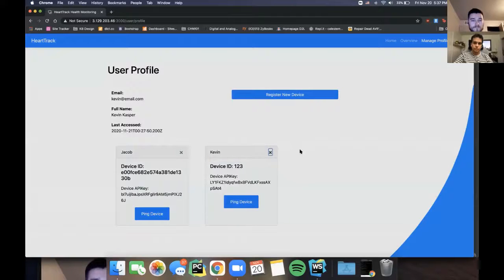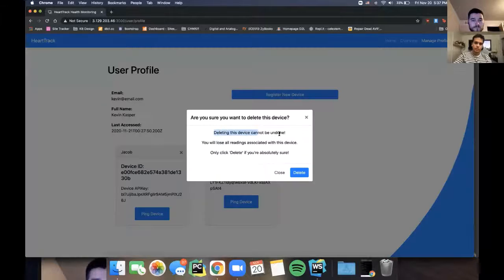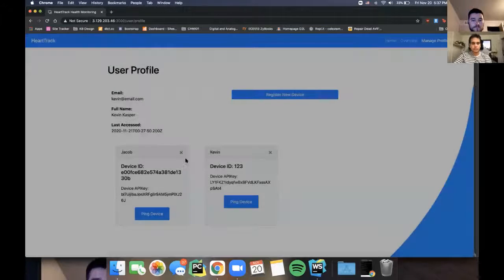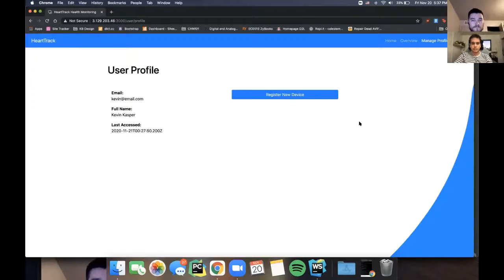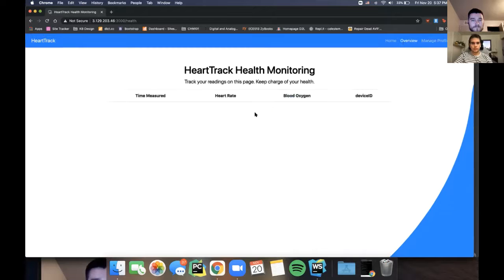You are able to delete devices. There's a warning that deleting the device cannot be undone. You will lose all of the readings associated. So we're going to go ahead and delete, and it clears automatically. If we delete the one that has readings on it, we can refresh the page and visit the overview, and you will see that all of the readings associated with the device have been removed.